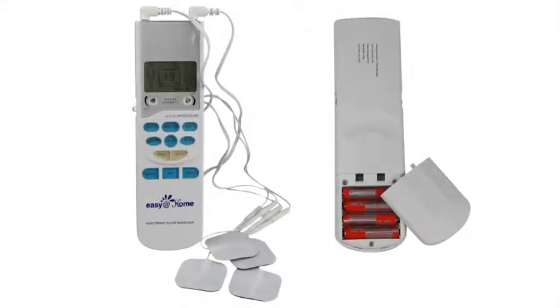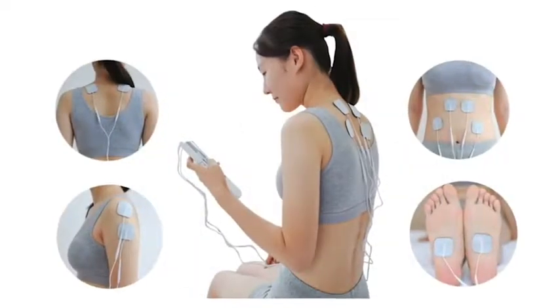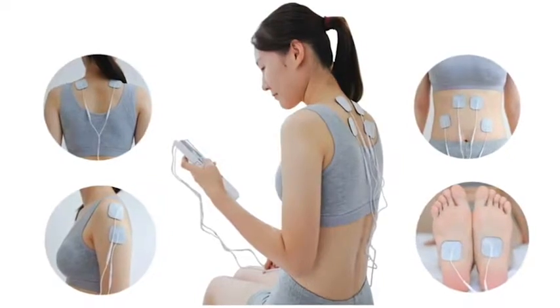Model EHE-009 has two independent channels, three massage types, and five auto modes. This comprehensive TENS offers a range of adjustable options.